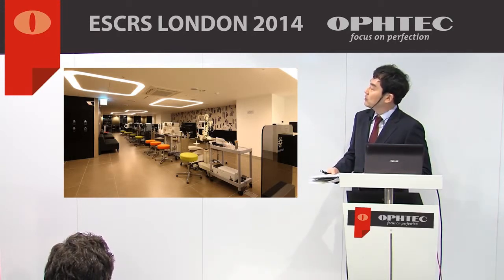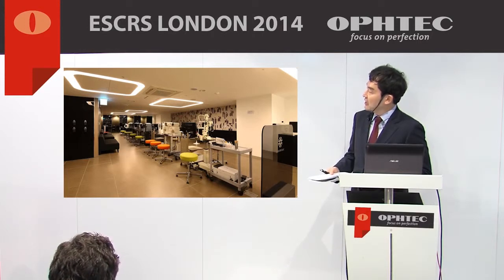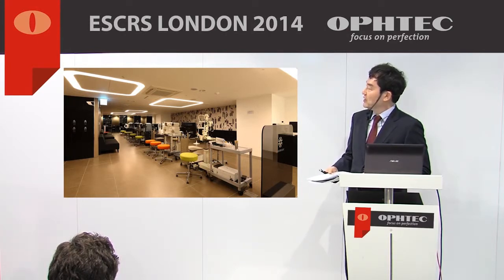Various devices are used for anterior chamber assessment before the surgery. If the clinic is equipped with all these devices, it would be very easy to compare and analyze the anterior chamber. But that is not usually the case. Also, although a clinic may be equipped with all these devices, if it has no manual for anterior chamber assessment, it would be very confusing as well.